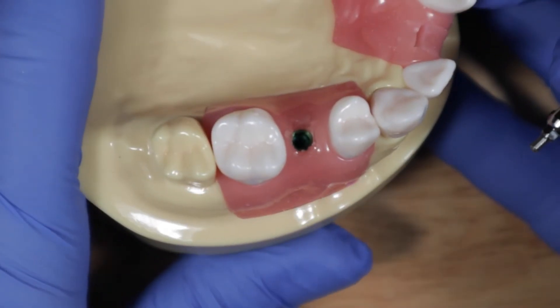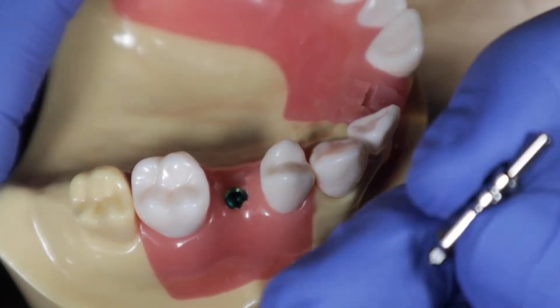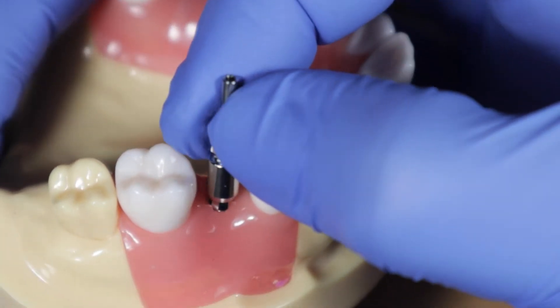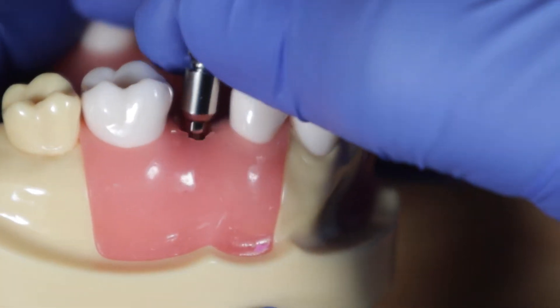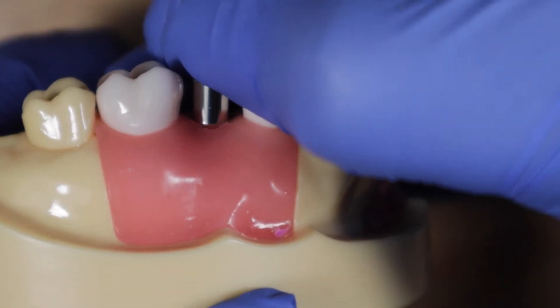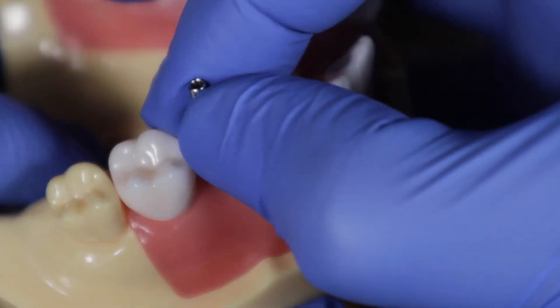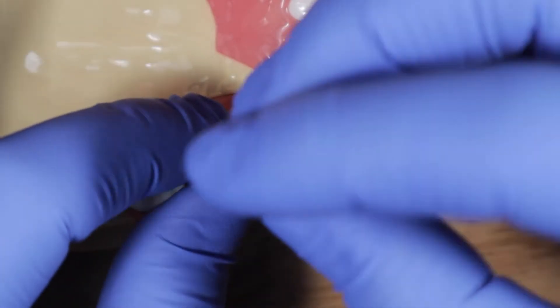Here's your implant, and here's your open tray impression coping. Hold the impression coping with your thumb and index finger, place it onto the platform, and as you place it, kind of roll your fingers — so you feel when it locks in. You roll it and you hear it and feel it go onto the platform. When you feel it lock in and do that little snappy thing, take your driver and tighten it onto the implant.